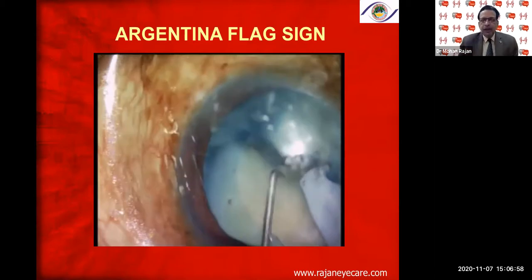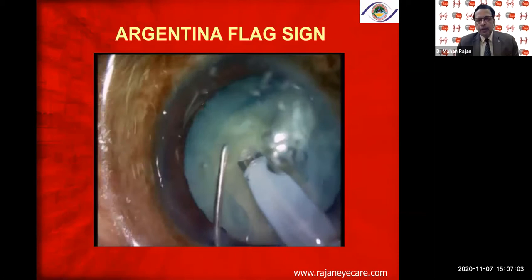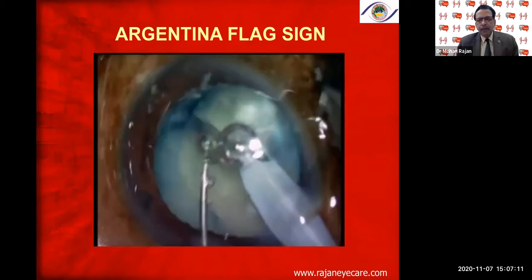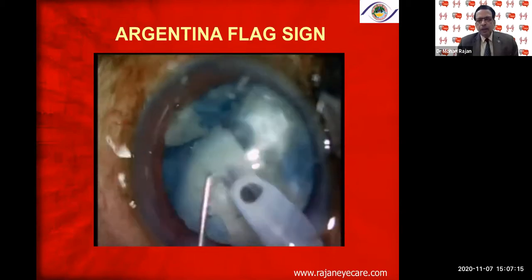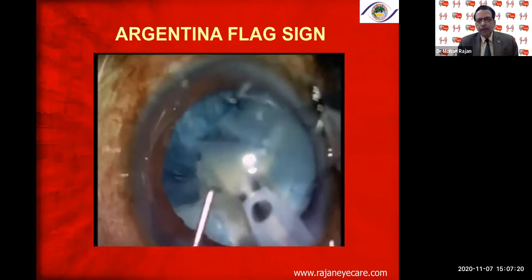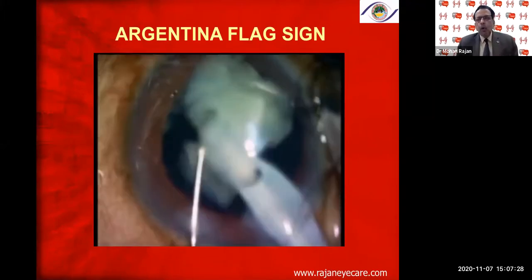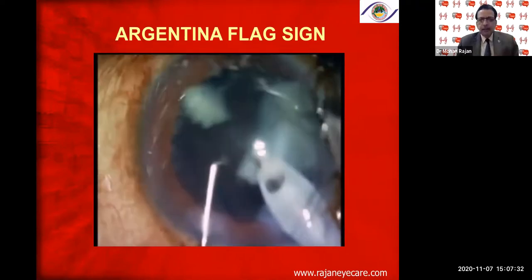and make sure there is no stress, especially on the 6 o'clock tear, which is likely to go across the equator into the posterior capsule as well. Try to bring this nucleus up into the iris plane, or sometimes even into the anterior chamber, making sure that you inject Viscoat or any dispersive viscoelastic for that matter into the anterior chamber to protect the corneal endothelium. Nowadays, I don't mind losing a few corneal endothelial cells, but I don't want the tear to go into the posterior capsule and the nucleus to go into the vitreous within a millisecond.